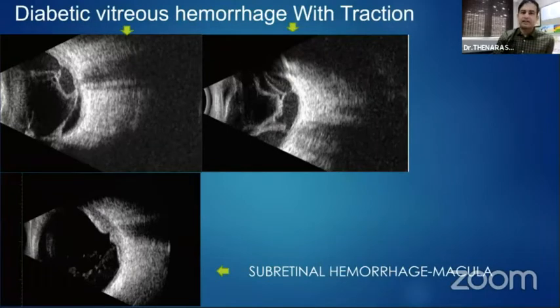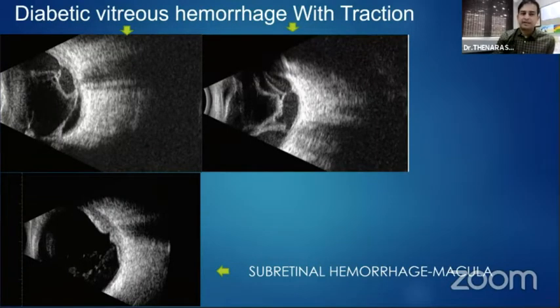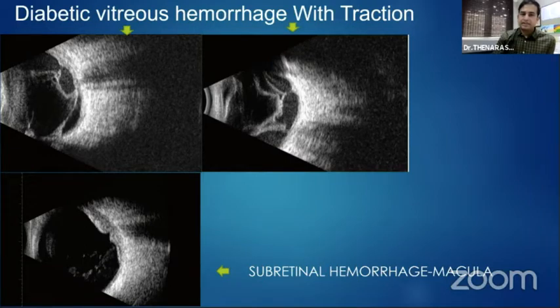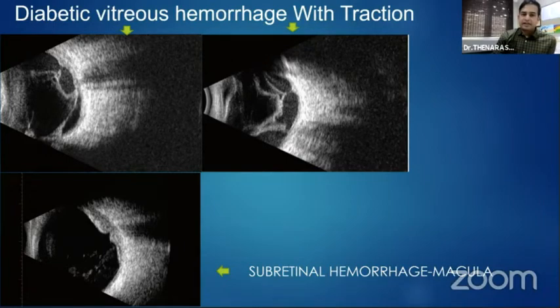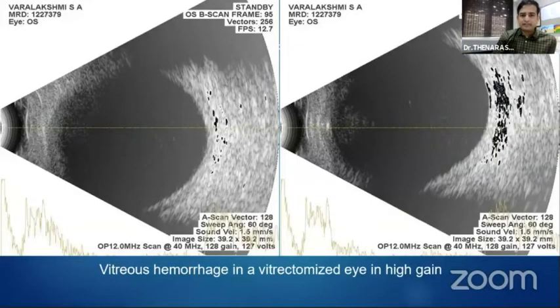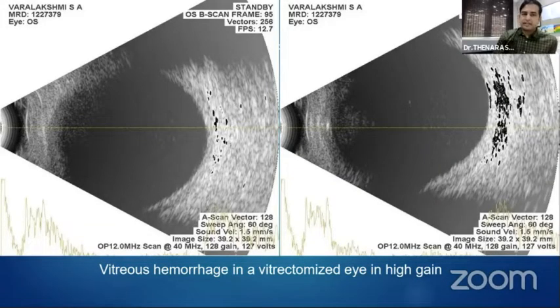In diabetic vitreous hemorrhage it is important to look for tractions — with underlying hemorrhage there will be fibrovascular tractions pulling the macula and retina. Ultrasound is helpful in planning surgery and explaining prognosis to the patient. In vitreous hemorrhage in the elderly population we should look for any sub-retinal hemorrhage at the macula, because the prognosis and visual outcome for these patients are very poor.